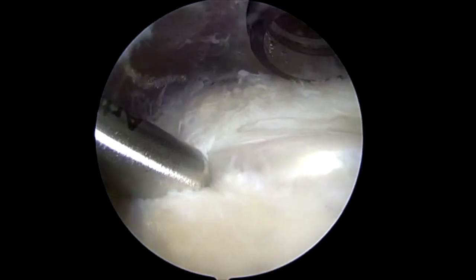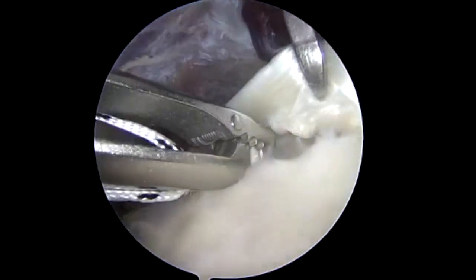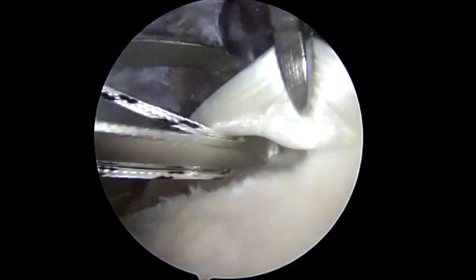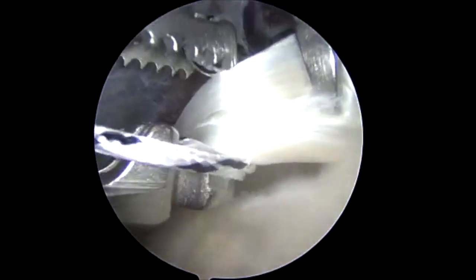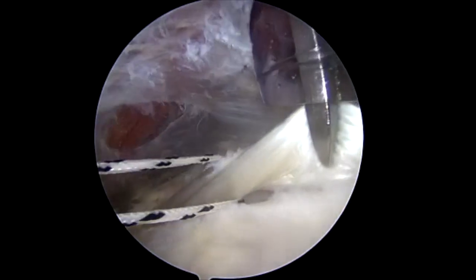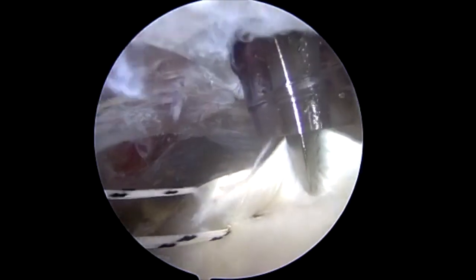The biceps tendon is unroofed and the transverse humeral ligament is released. The biceps tendon is elevated with a grasper and a 1.3 mm suture tape is looped around the biceps tendon using an antegrade suture passer and then cinched.